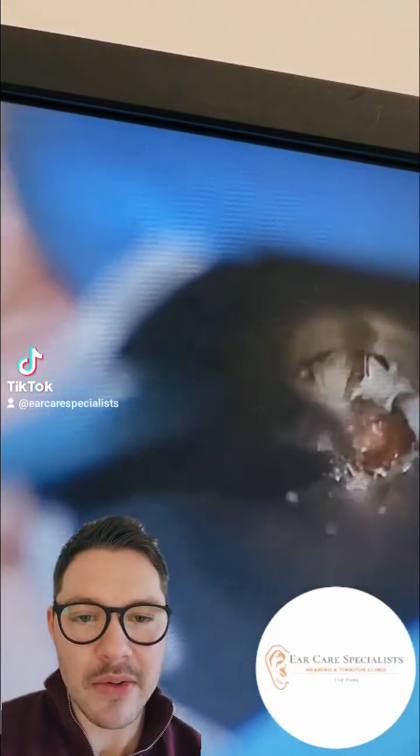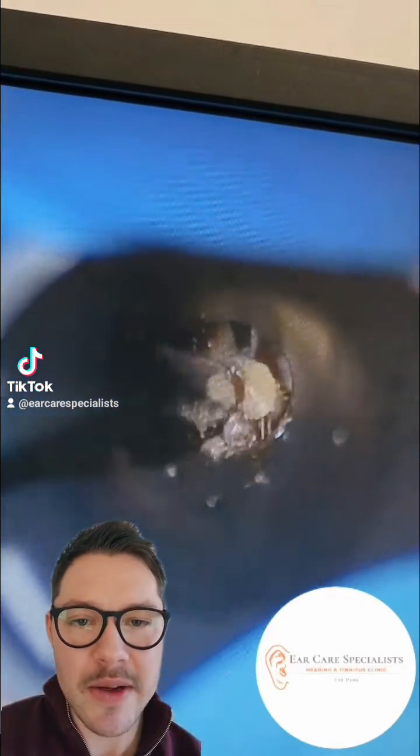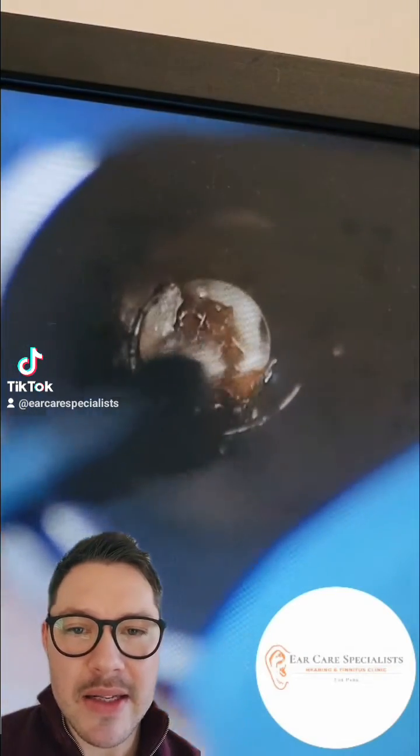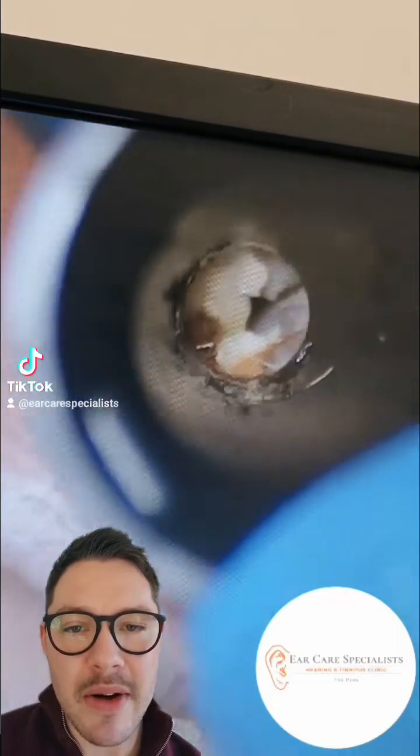Some of that wax comes straight out, goes down the suction nozzle into the sealed canister, and as we start to pull some of the wax out, there you can see this white skin deposit in the background there.